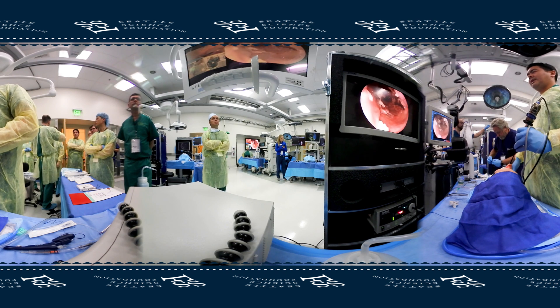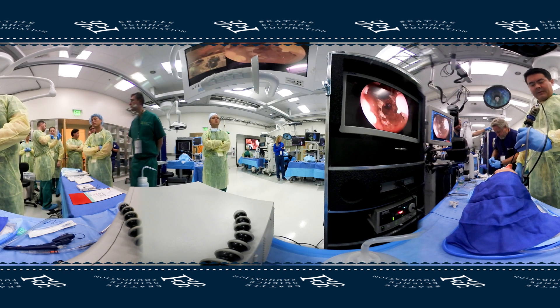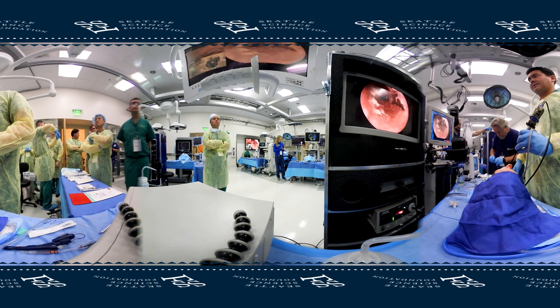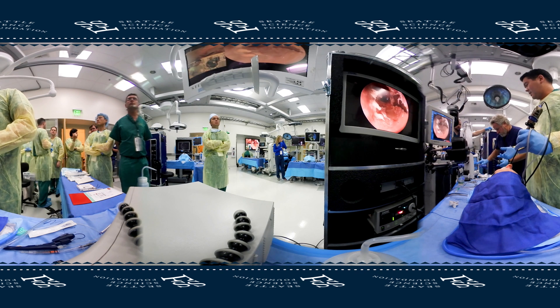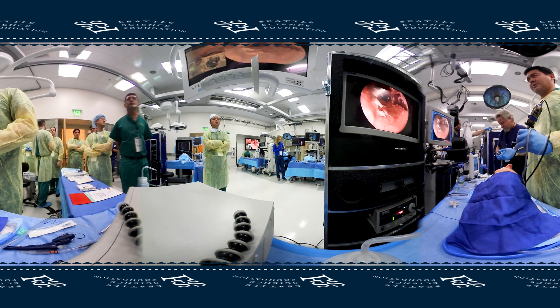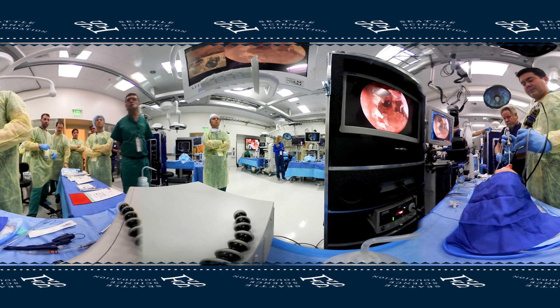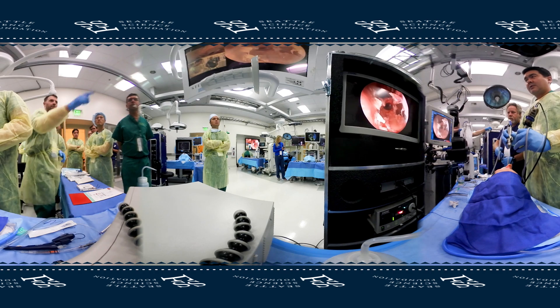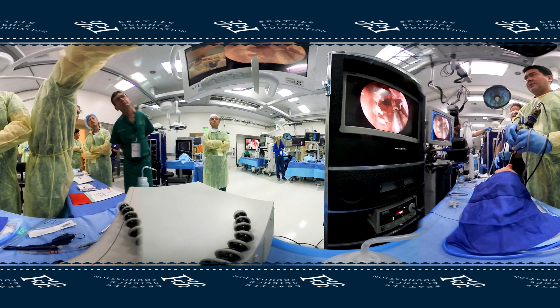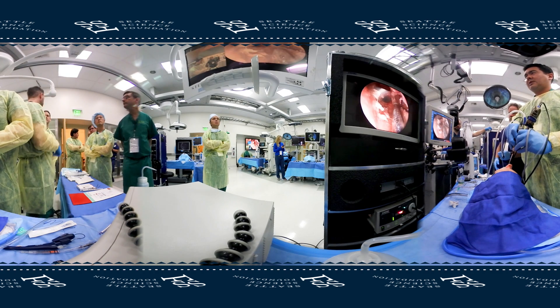If you really need access to the most anterior portion of the maxillary sinus, you can use a 70-degree scope or even use a transeptal approach and come from the other side as well. Then we're just going to take this down by drilling.